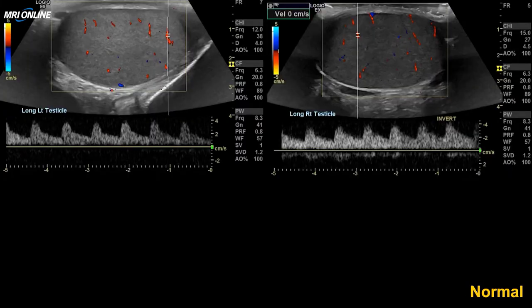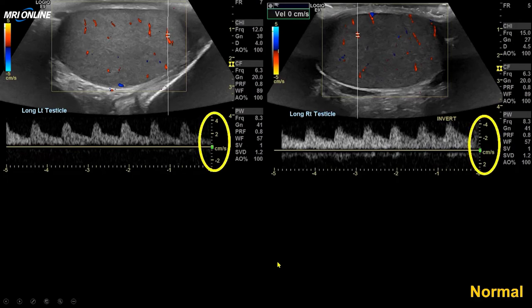Again, more normal here. Our settings are the same, our scale is the same, and our numbers for the color flow Doppler are the same.